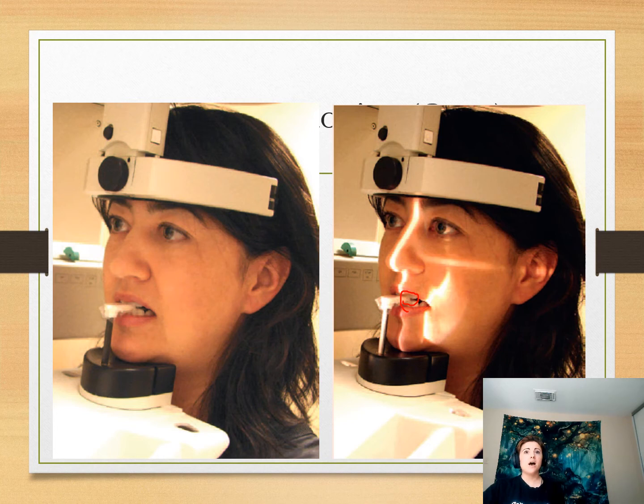And then you'll want to make sure that her mid-sagittal plane is perpendicular to the floor, right? These lines are really nice because it's in the center of her chin, it's in the center of her nose, it's in the center of her lips, right along the philtrum and the tubercle there. And then you'll make sure it goes right in between her eyeballs. We're looking at her from an angle, so it's a little different. This is also a light that kind of wraps around the head, so it's not exactly perfect when you're looking at it from the side.